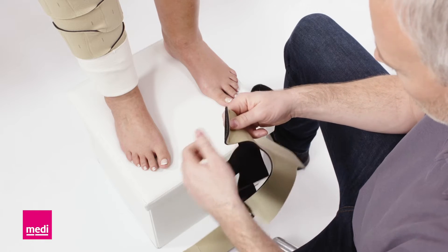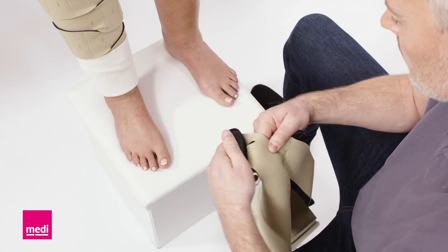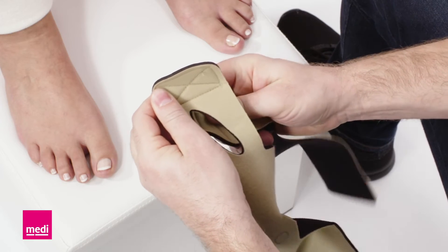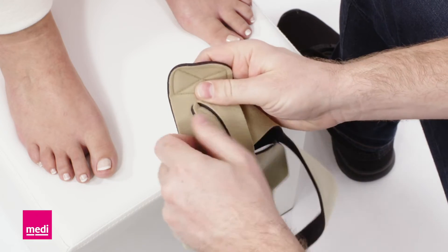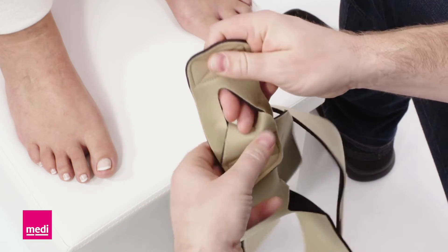Firstly, detach both heel bands. Pass one band through the opening of the other band. Attach the two bands loosely to the outside of the foot wrap.